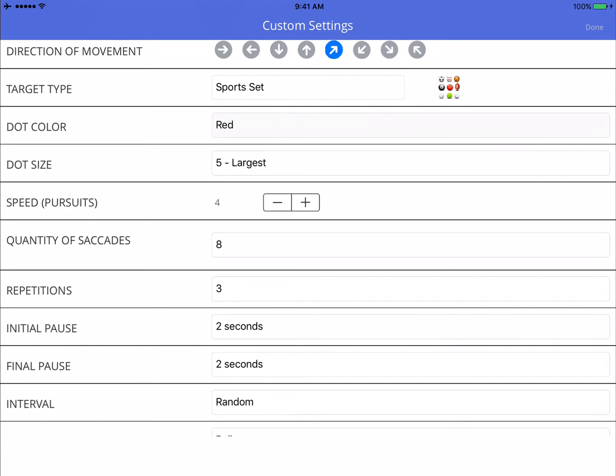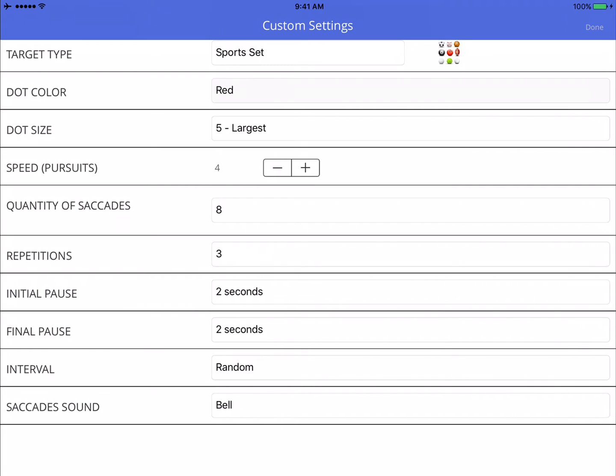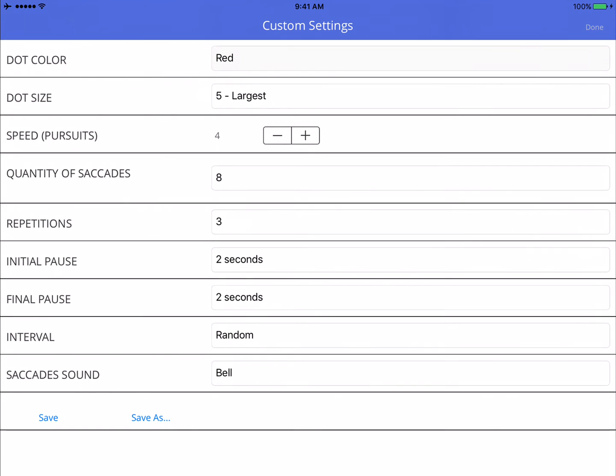And quantitative saccades, 8. His visual map is very distorted and inaccurate, so we want small saccades and multiple small saccades to help restore that visual map. So I'm going to do three reps. Initial pause will be two seconds. That will give him enough time to focus on the target and get ready to start following the eye strategy.